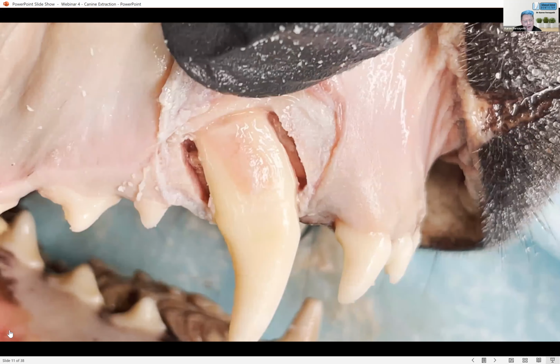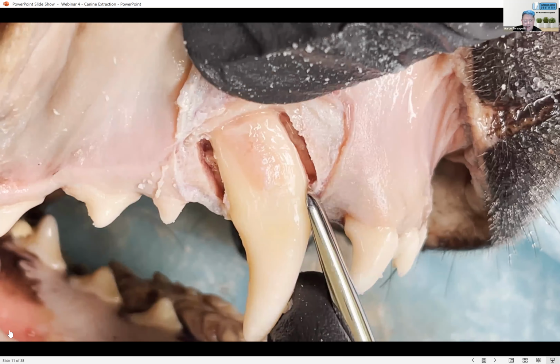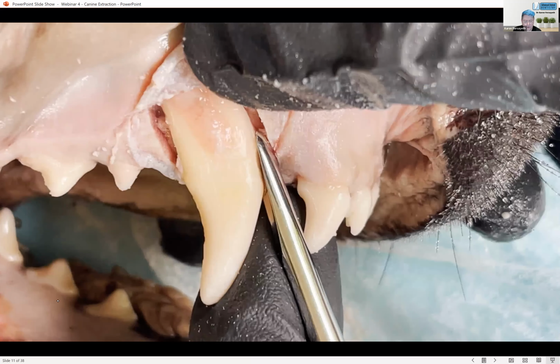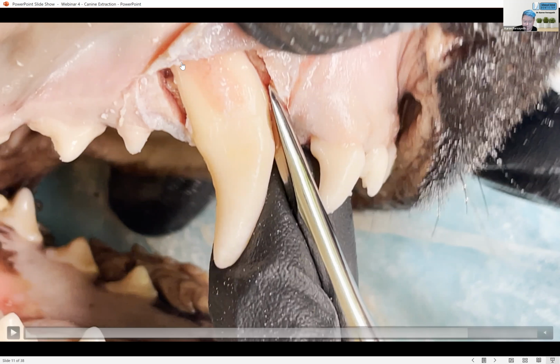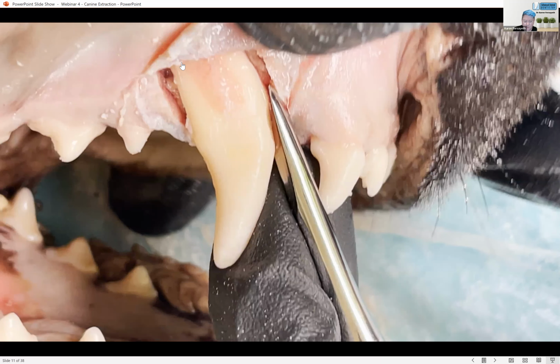And what we should know from our previous knowledge about anatomy, the bulk of the holding power of any root is in this top 30%, the coronal 30% of the alveolus. So with this having been done, we now have no attachment on this buccal surface. With the deep trenches on either side, we have no mesial attachment. We have no distal attachment. In this coronal 30%, and this is getting probably close to 40% actually of the root length, we only have palatal attachment. So we've reduced this by a significant amount already.